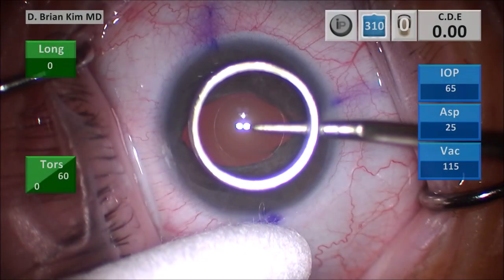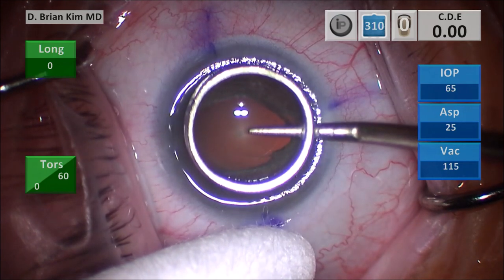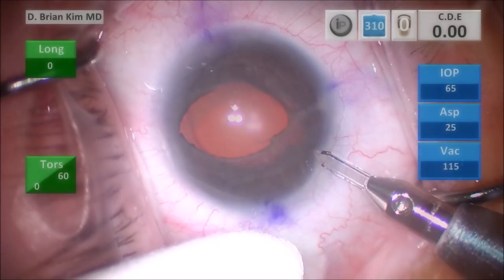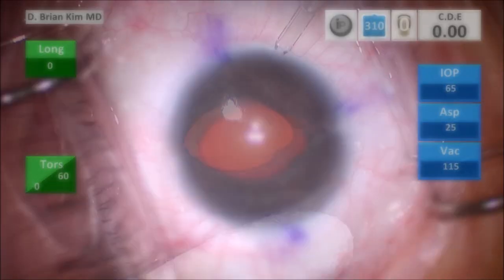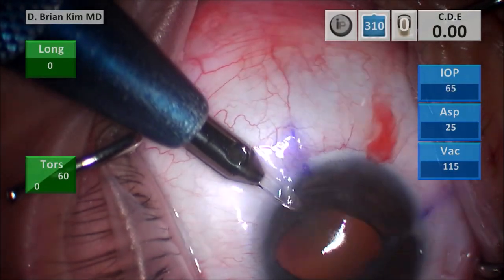I'm using a corneal mark to help me center and size my rexis. Note how much larger the ring looks compared to the cornea — this is because she does have a very small cornea. I'm going to go ahead and make my paracentesis incisions for the iris hooks as well as my incisions for my actual cataract surgery.